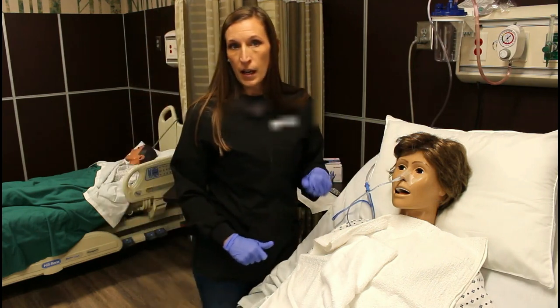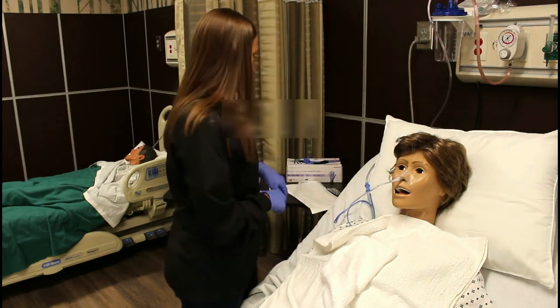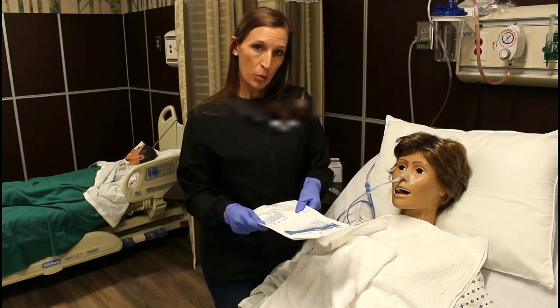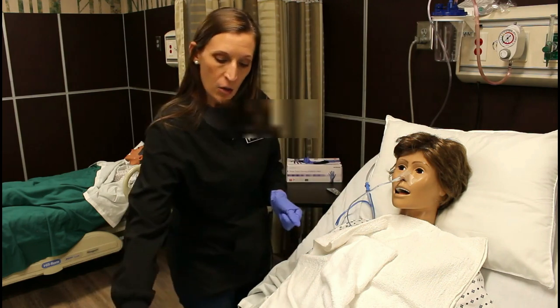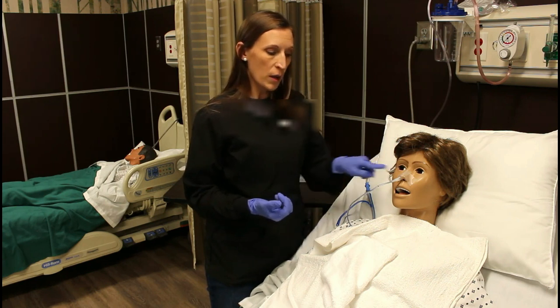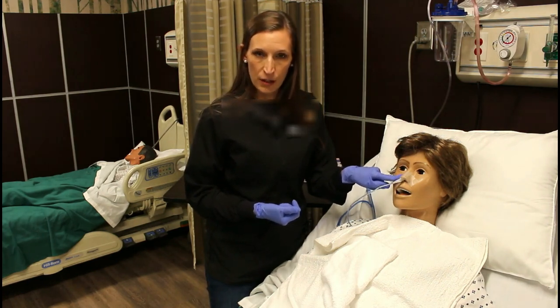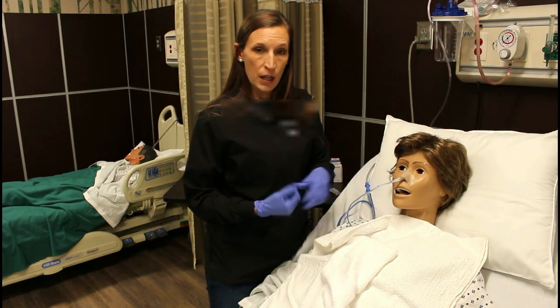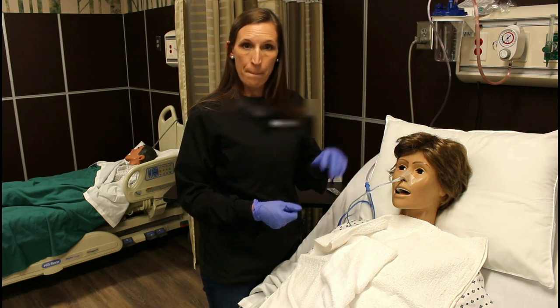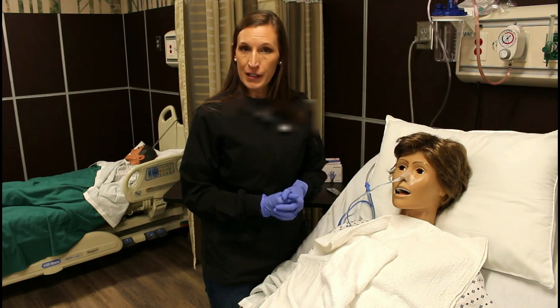Now we'll get our x-ray and go document in our chart. We're going to document the size and type of tube we put in — this one is a 10 French Salem sump tube. We're going to document the color of the fluid, the pH of the fluid, which nare we put it in, how the patient tolerated the procedure, if the patient is having any pain afterwards, whether we left it taped closed or put it on suction, and that we ordered the x-ray. After that, you are finished with your skill.